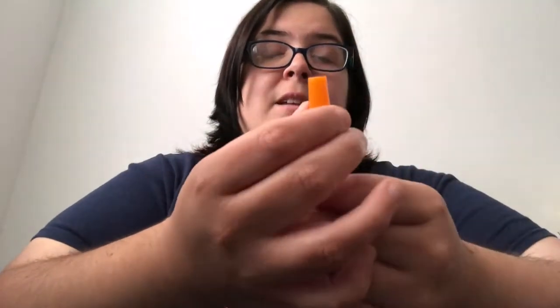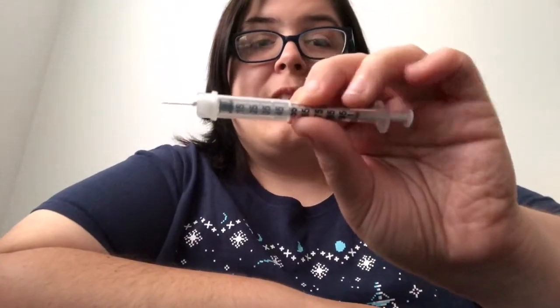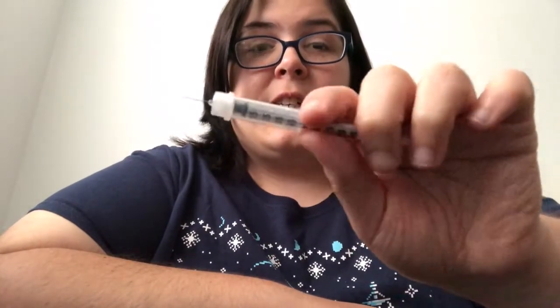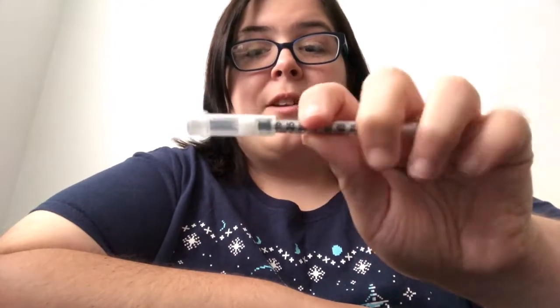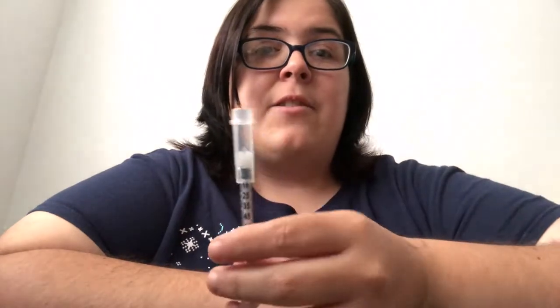When you take the cap off the needle, you can see this is another small needle. How easy it is when you're done giving the insulin injection or whatever you're doing with the needle. Literally, you don't even need more than a finger. Now look at that. The needle is covered up. You can't see it anymore.